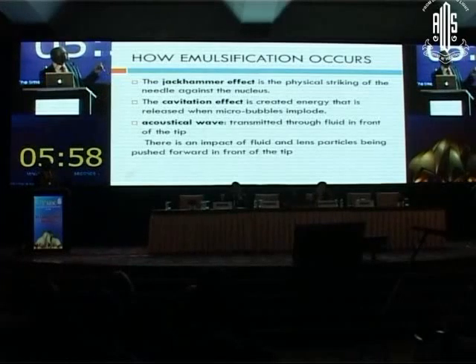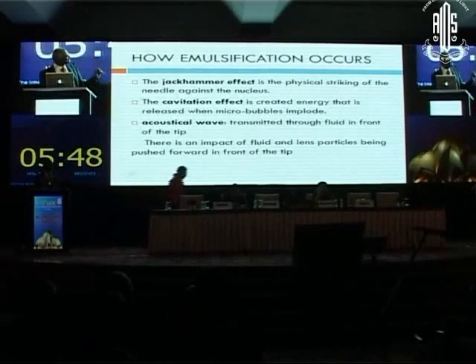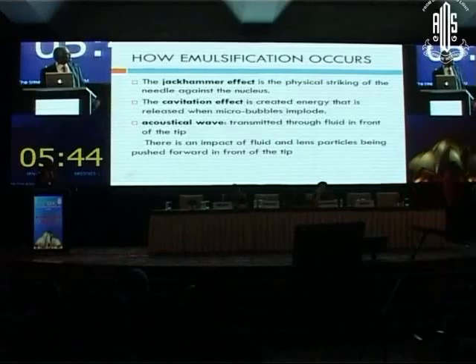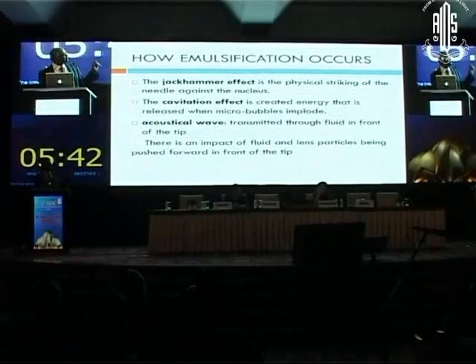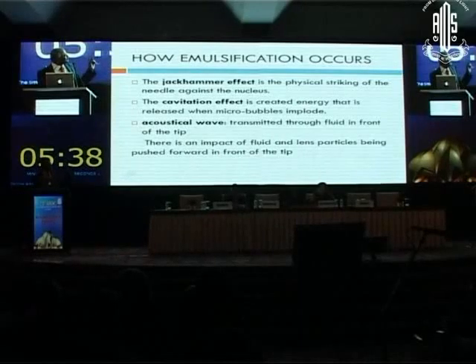Now here is how this works. It is a jackhammer effect, the physical striking of the needle against the nucleus. It is a physical phenomenon. And the cavitation effect is created by energy that is released when the micro bubbles implode. There is an acoustic wave transmitted through the fluid in front of the tip. There is an impact of fluid and lens particles being pushed forward in front of the tip.